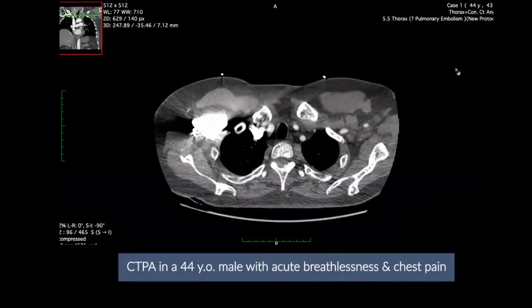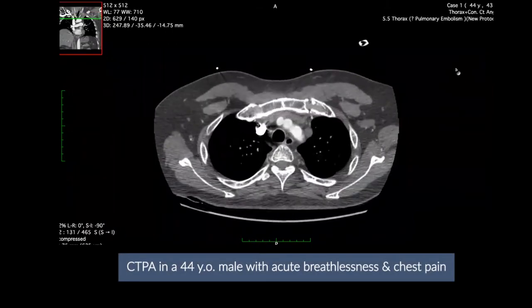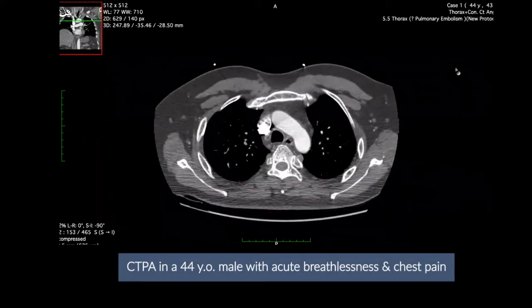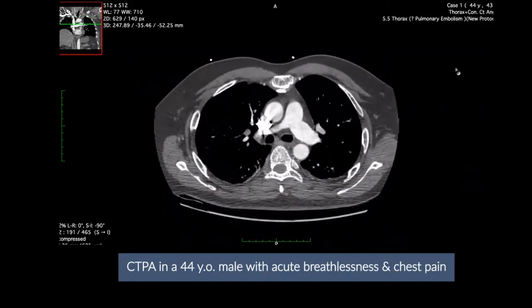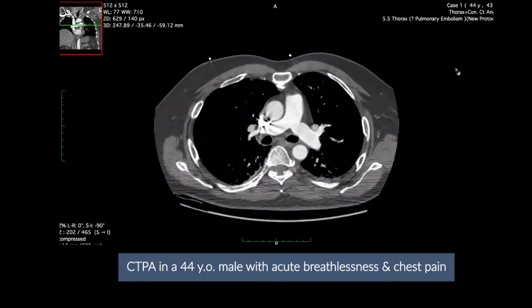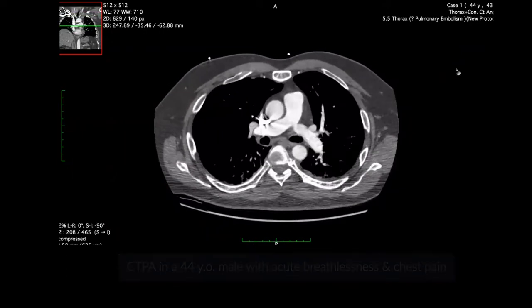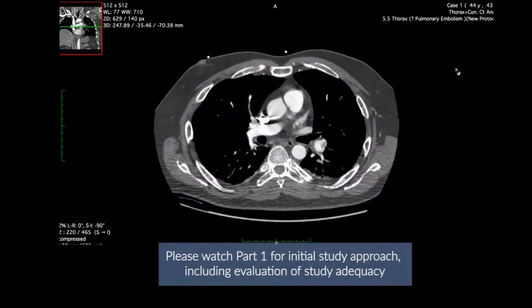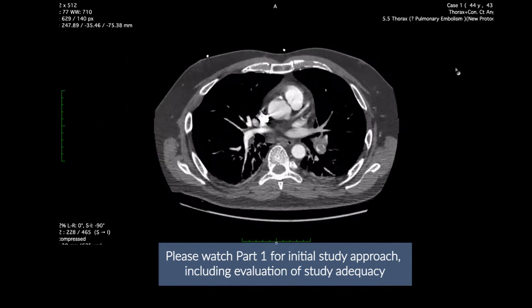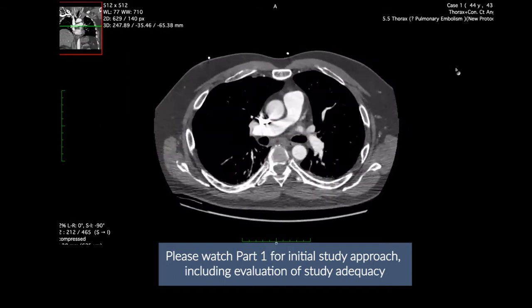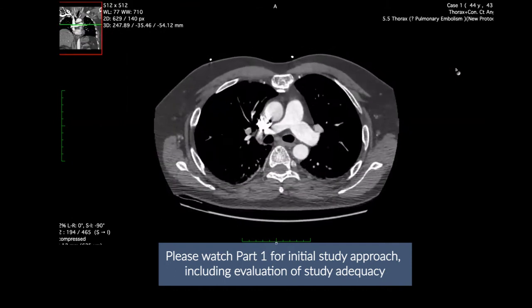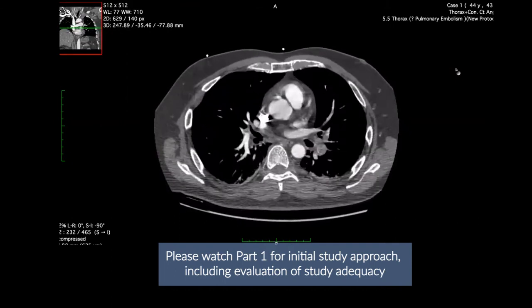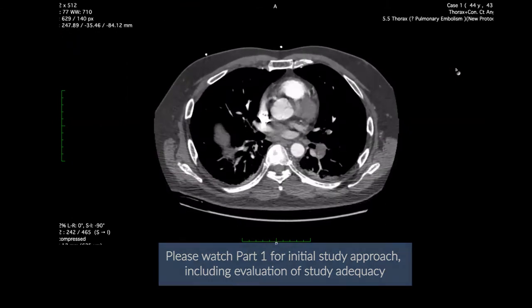Here are axial images from a CT pulmonary angiogram of a patient who came in with acute breathlessness and chest pain. In this case we can see that the pulmonary arterial enhancement is overall satisfactory for evaluating the pulmonary arteries to the segmental and sub-segmental level.